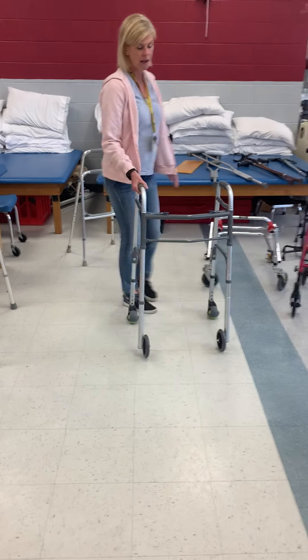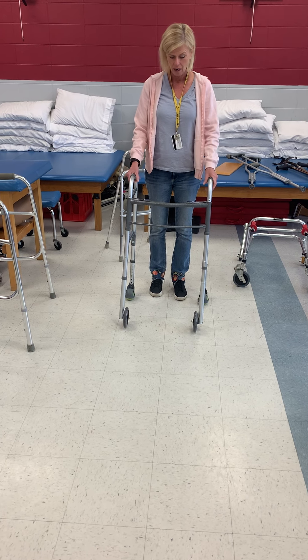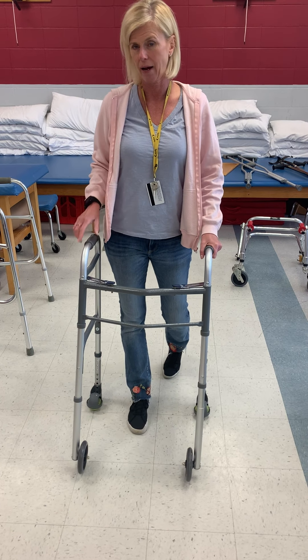Once they are a little bit more coordinated with a walker and their balance allows them to move to a rolling walker, we want to advance them so that they can have a normalized gait pattern.